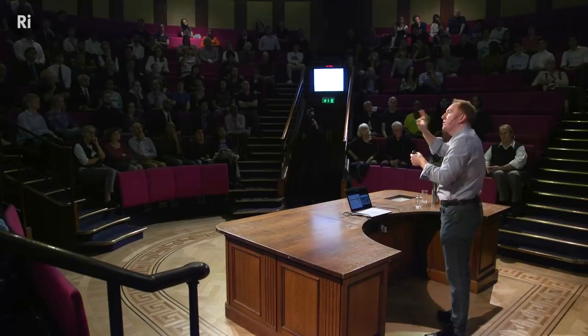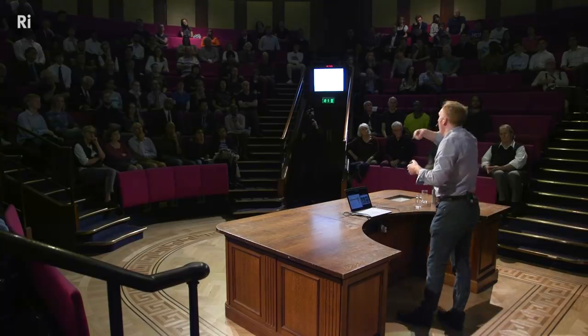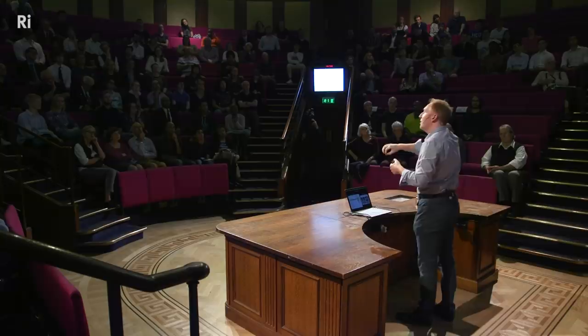You make sure that by sending it round a curve, you filter out those that aren't at exactly the right energy that you want. And then after it's been round that bend, you slam it into a target, and when it hits that target, it stimulates X-ray emission. And it's those X-rays that then get directed at the patient and are used for the treatment.